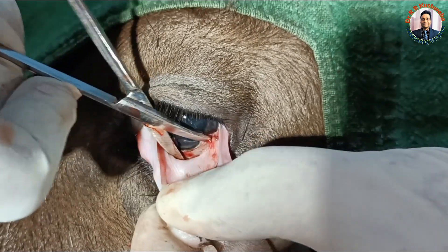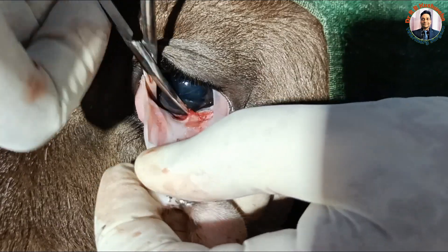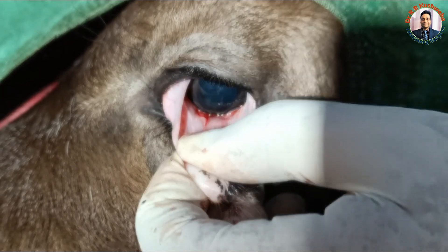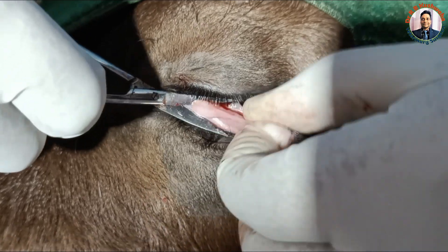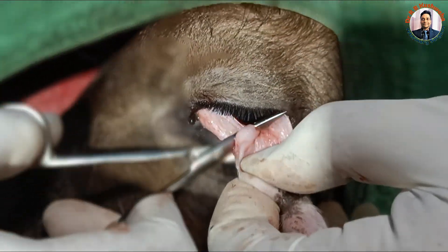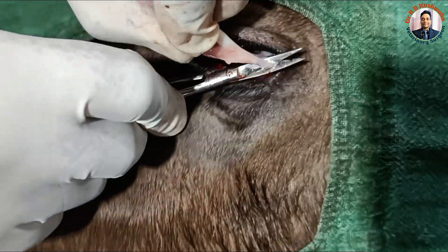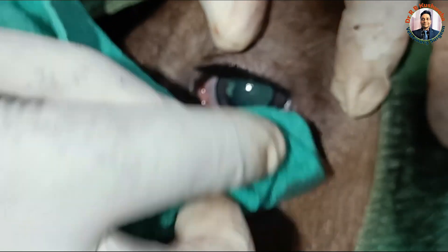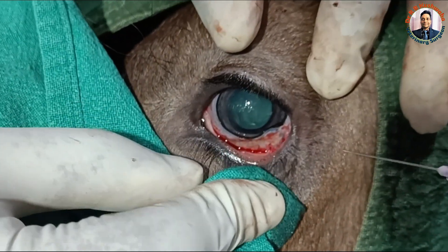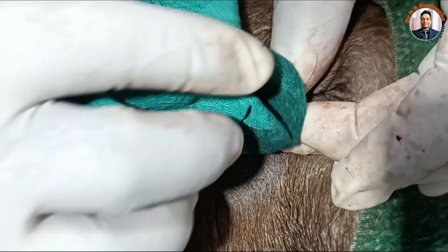Here again I start very close to this one. We slightly undermine the hair, and then sharp excision from this side — we just excise sharply close to this margin. We will put a few drops of adrenaline to stop the bleeding, and let's close for a few seconds.